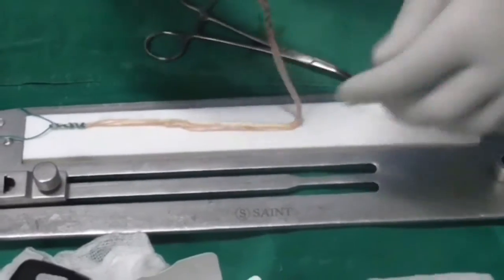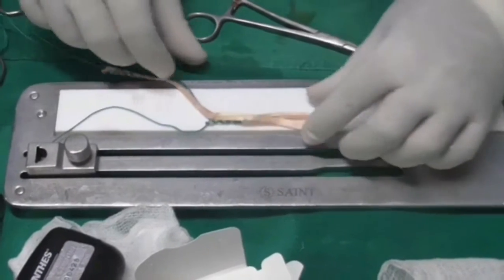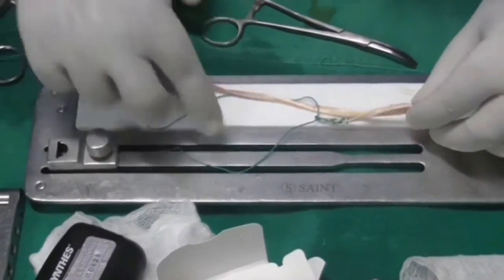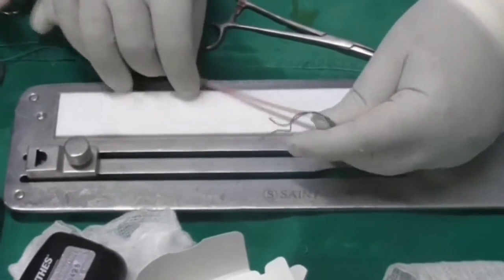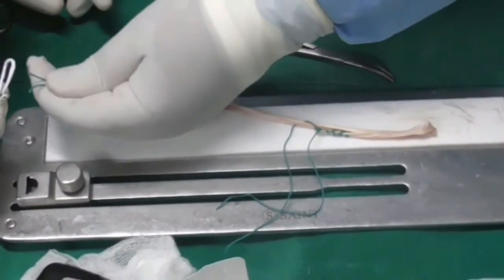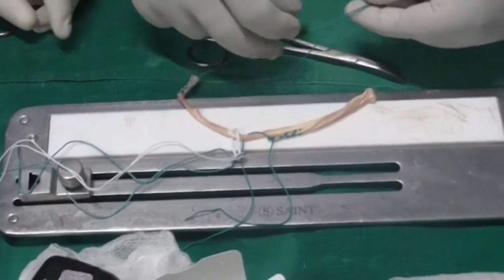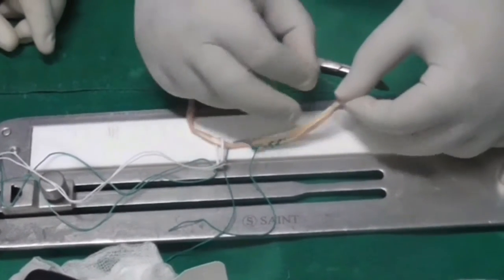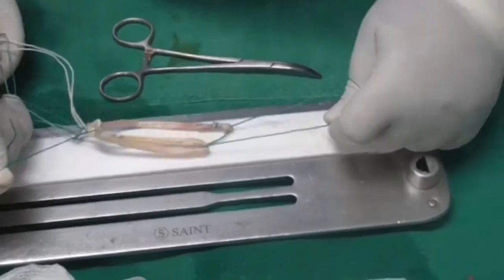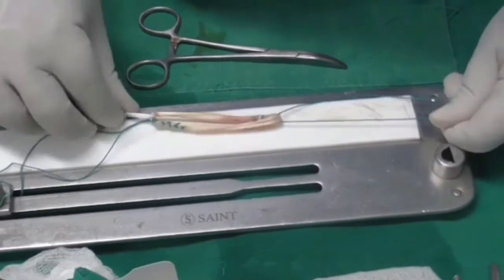Now I'm going to demonstrate how this can be loaded into the endobutton device. In the first stage of triplication, you loop from one third and bring it to the opening of the ethibond. From the other end, we pass our loop of the endobutton through. The endobutton loop goes there, then the end comes back to the loop of the graft, and both ethibond sutures are pulled apart, triplicating the graft on the endobutton loop.